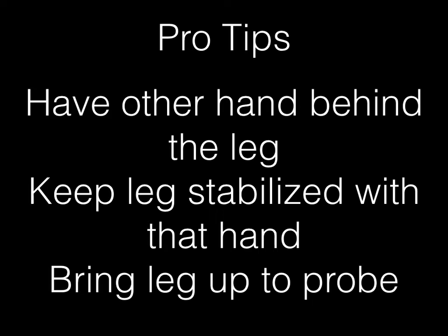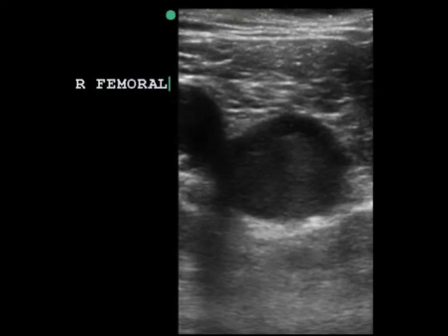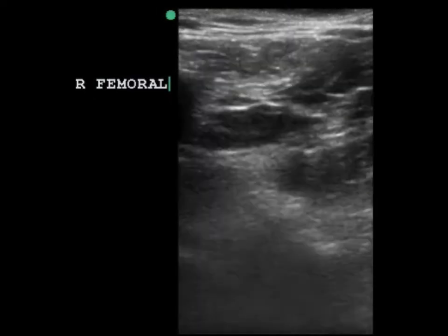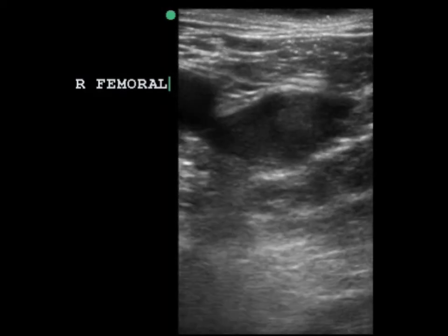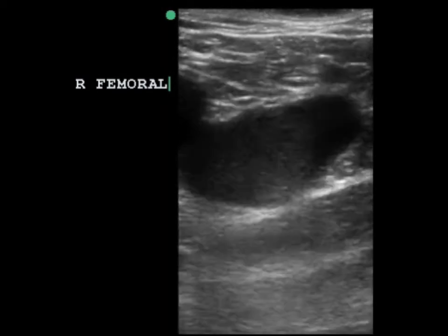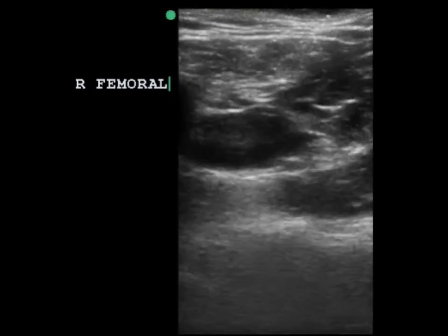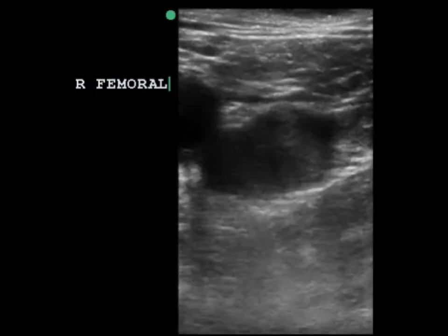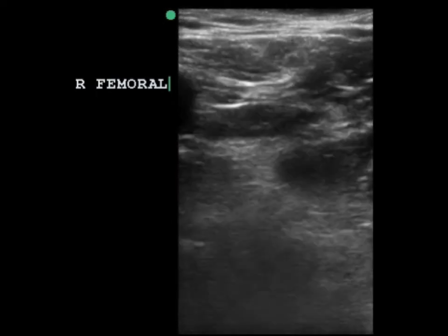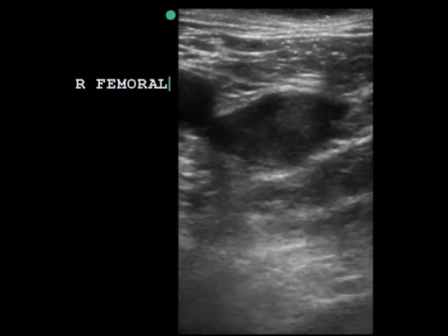We've looked at a lot of negatives. Let's look at a couple positives for now. This is at the point quite high up, and in this case, we have some clot within the common femoral vein. This is a right leg. We can see the common femoral artery just to screen left, and we can see that there's some echogenic clot within the common femoral vein. Even if we didn't see it, the fact that we can't compress tells us that there's something within the lumen, clot.